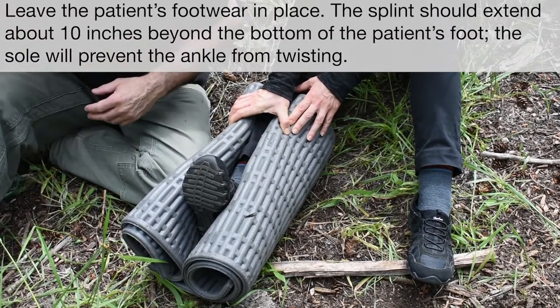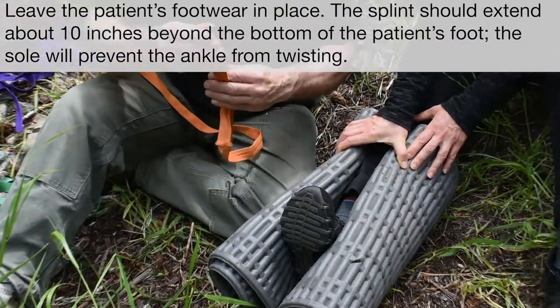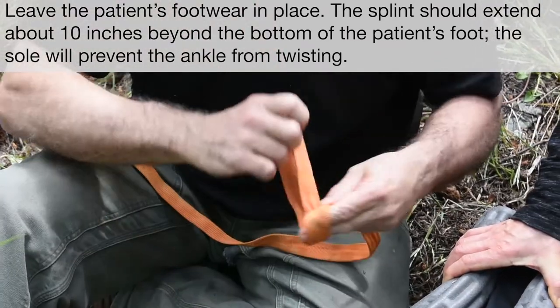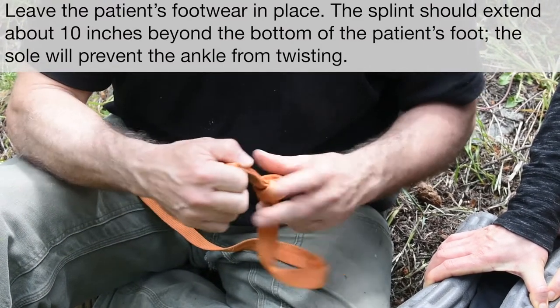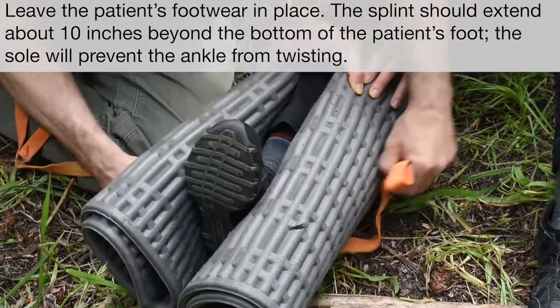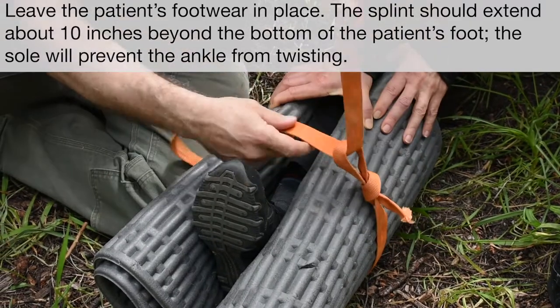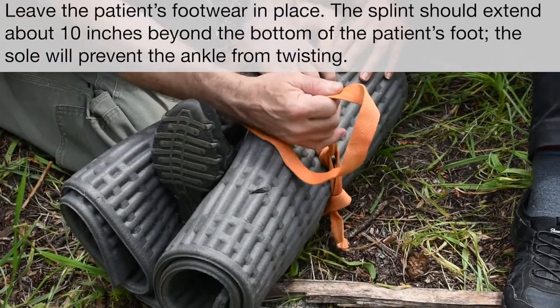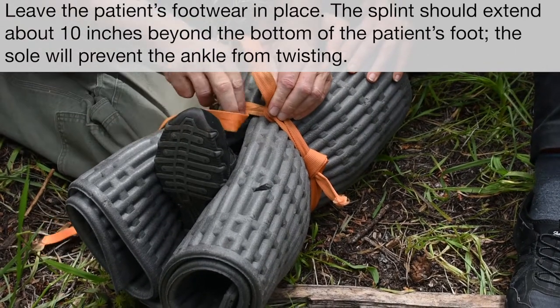In this one I'm going to use just webbing straps. The first thing you need to be able to do is tie a simple overhand knot on a bight — so you fold it in half, spin it around, and tie the knot. Then we'll slide it underneath the splint, lift up a little bit, and this first one goes around the ankle itself.